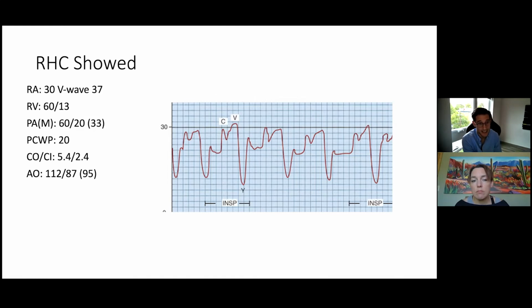CVP is very high, and she has high right-sided filling pressures. Left side, we can say they're high by definition. But this is a hard case because we tried to diurese the patient, right? And it didn't work, I feel, right? She was not having no output. I would tell you, I'll be sincere. Yeah. But yeah.